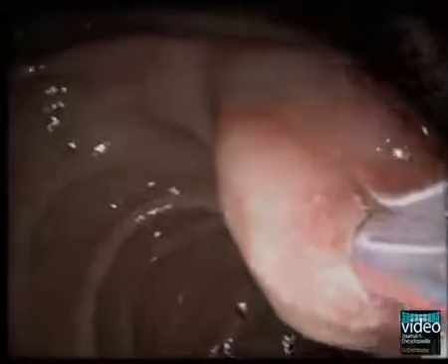Guided by the wire, the sphincterotome is advanced within the duct. The triple lumen allows for concomitant application of contrast medium. In the present case, a regular common bile duct and a normal intrahepatic duct are visualized.